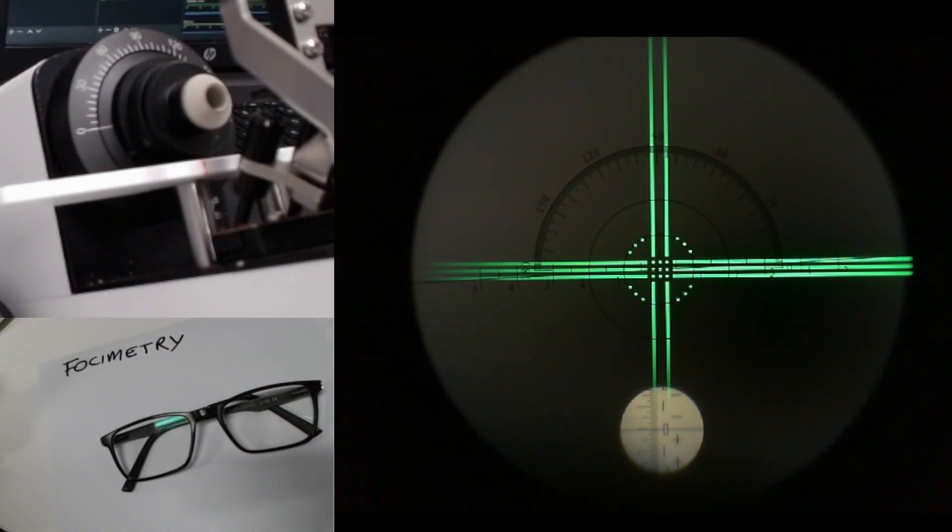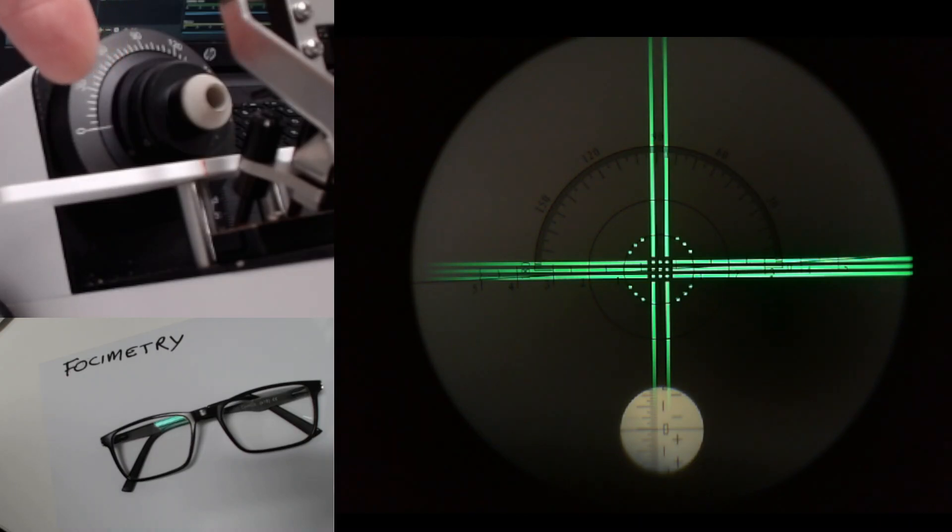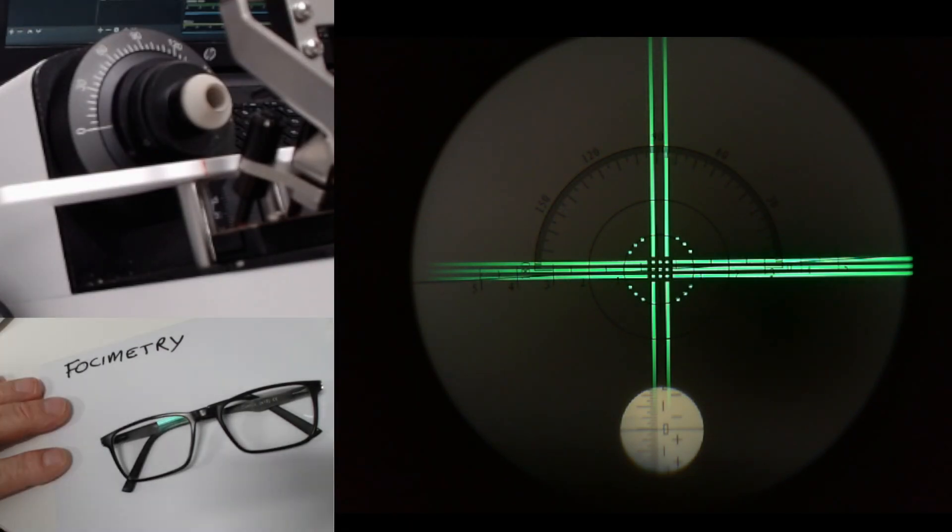I would suggest that we use the internal display of the focimeter to work out the sphere and the cylinder powers, and that we use the external axis scale here to read off the axis. There are technical reasons why I suggest that we do it this way, which we can talk about down the line if need be.